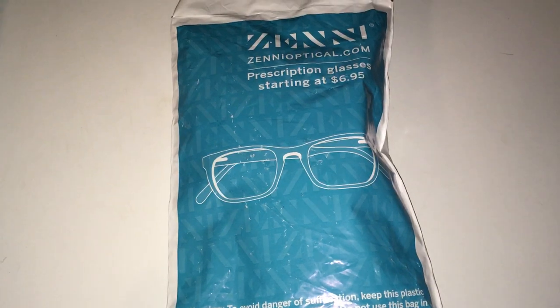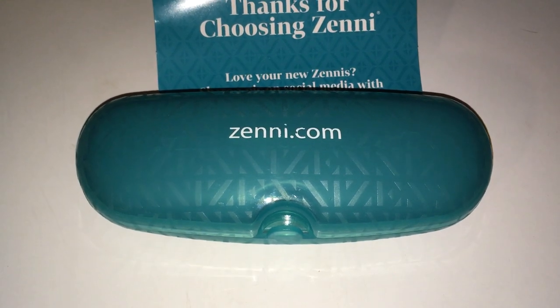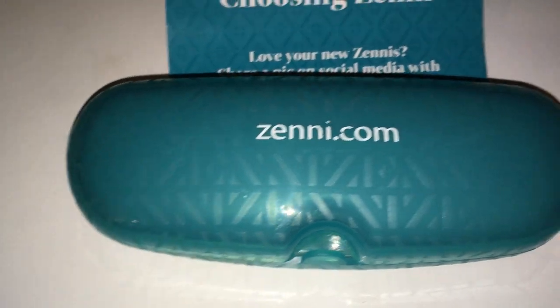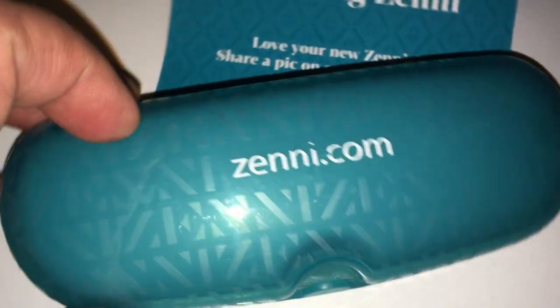This is how they shipped it — this nice little bag. Pretty cool, simplistic, but cool. This is what we're looking like as soon as we open the package. We have a nice little glass case — a Zenni glass case. It has some real subtle Zenni letters on the background there.